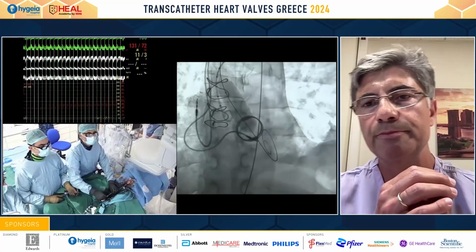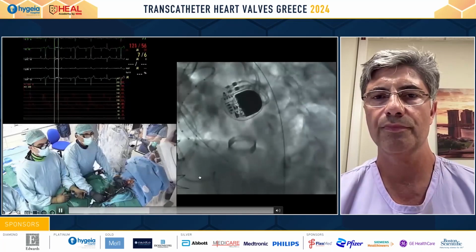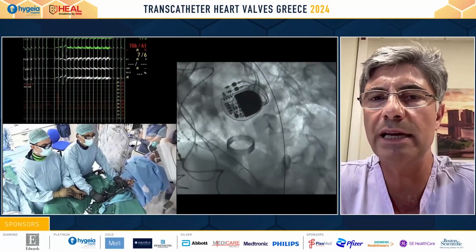It was a great comment. You're absolutely right. With Edwards, we don't normally predilate, but in this situation, we felt we should predilate in order to minimize any possible slippage of the valve, because we want to be as accurate as possible. You can see the predilation. There's a nice opening of the valve. And you pace on the wire. Yes. That's our practice. I think it's better pacing with a lot less complication.